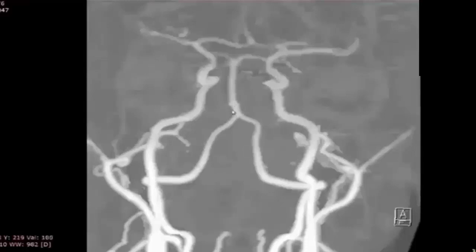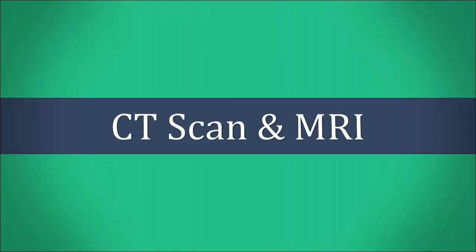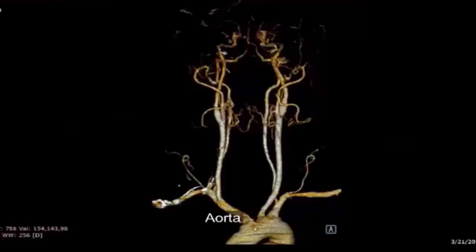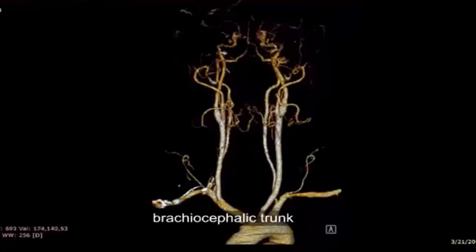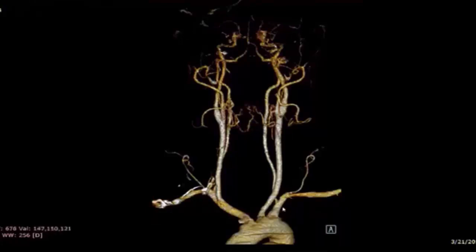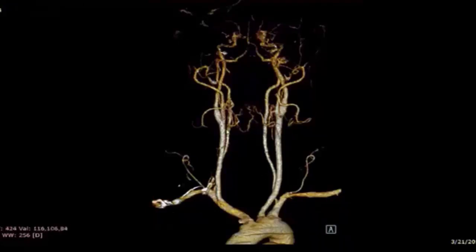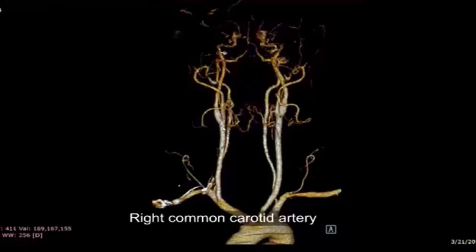Basilar artery, brachiocephalic trunk, right subclavian artery, left subclavian artery, right common carotid artery.